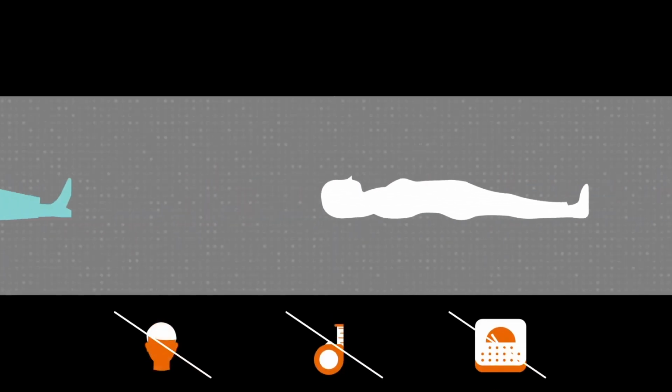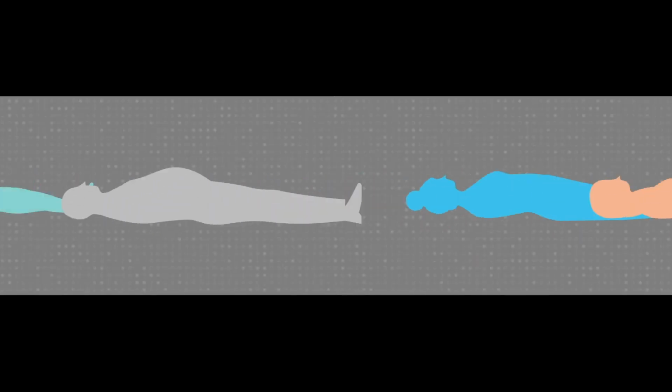Nowadays, almost all patients can be examined using CT. That includes those who find it difficult to lie still during a scan. Age, height, and weight are no longer a factor. However, because of radiation exposure, pregnant women should only be examined with a CT scan if the diagnosis cannot be made any other way.